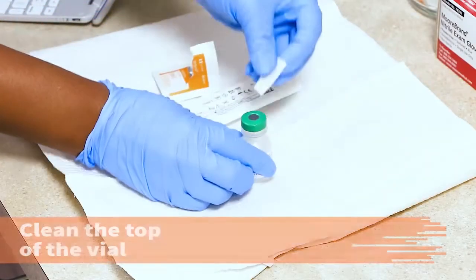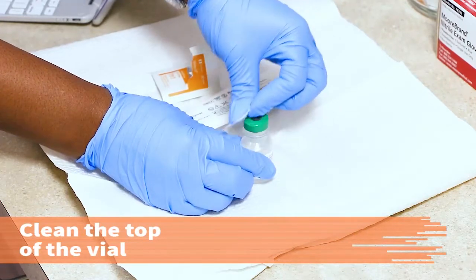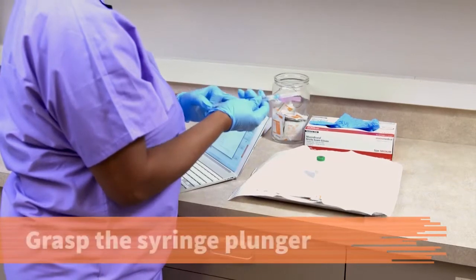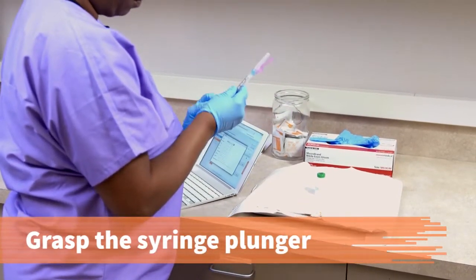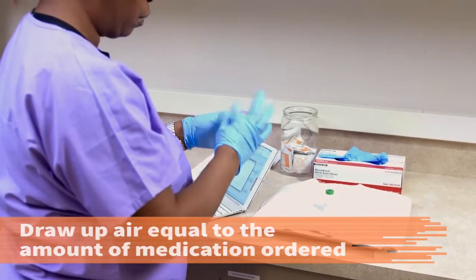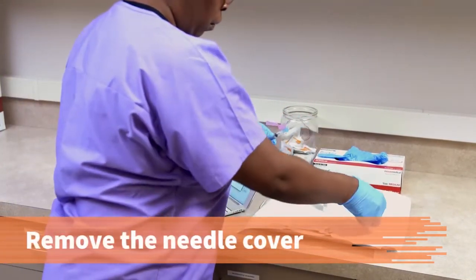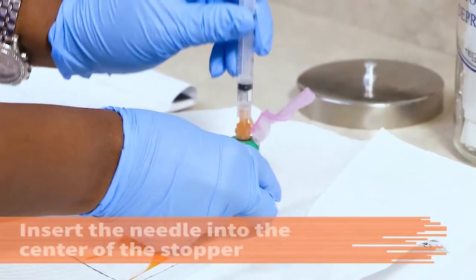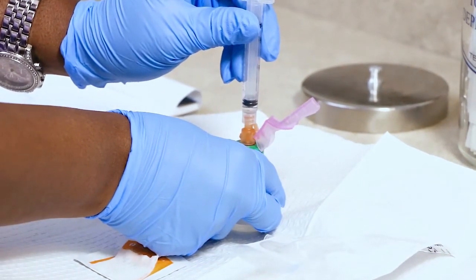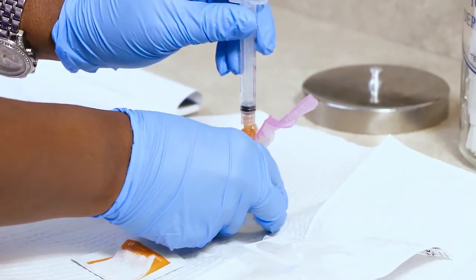Clean the top of the vial with the alcohol wipe using a circular motion. Place the vial on a flat surface. With the needle cover in place, grasp the syringe plunger and draw up an amount of air equal to the amount of medication ordered. Remove the needle cover. Hold the vial firmly against a flat surface and insert the needle into the center of the rubber stopper. Be careful that the needle touches only the cleaned rubber area. Inject the aspirated air in the syringe into the vial, making sure the needle is not in the liquid.